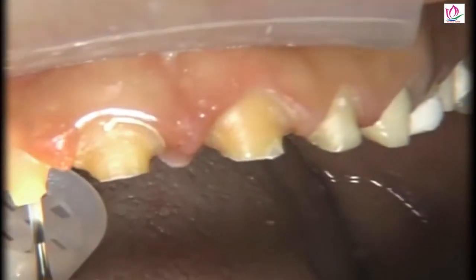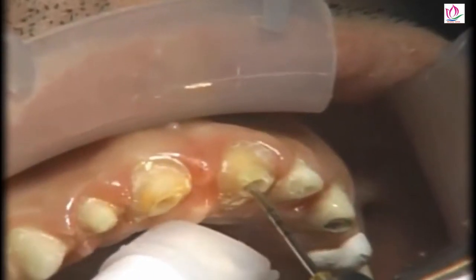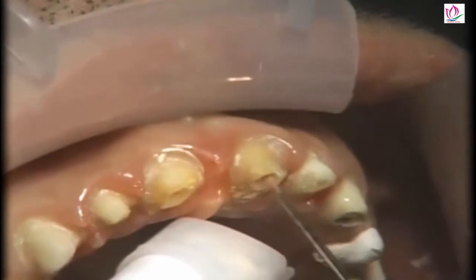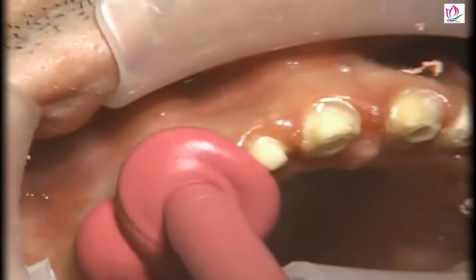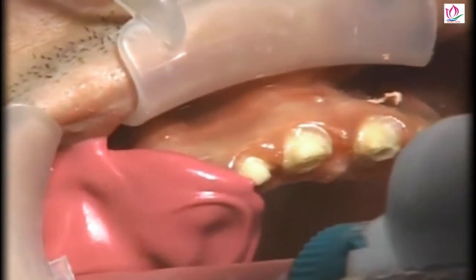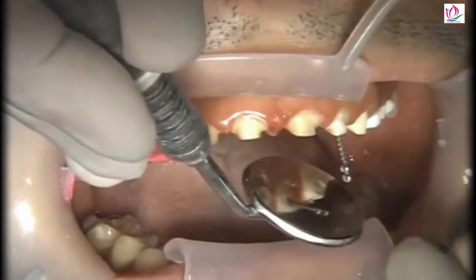The anterior biotemps fell off several times while the patient was awaiting his next appointment, so we decided we probably did not have enough retention on the anterior teeth to retain the single-unit cap-tech crowns. If they didn't stay in place while splinted together, the chances of them staying as single-unit crowns was definitely in doubt. So we decided to place post and cores on teeth number seven, eight, nine, and ten. This is a little bite registration on the adjacent teeth which have not been anesthetized — I'm just covering those up because the air was a little sensitive — and we're going to continue to remove gutta-percha on teeth number seven, eight, nine, and ten.